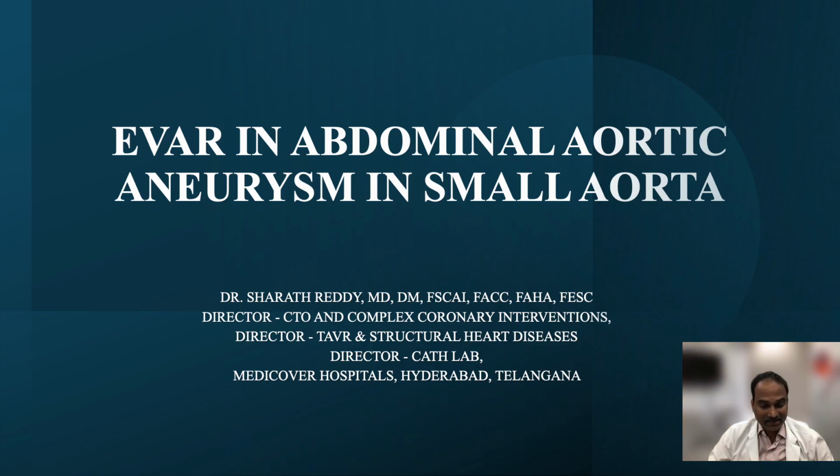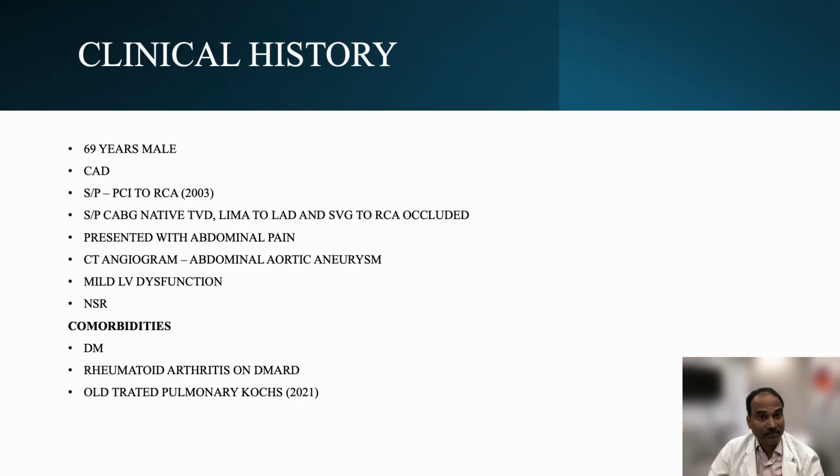Today's case is an interesting case, away from our routine cases of coronary CTOs and complex PCI or CHIP PCI. This is a case of abdominal aortic aneurysm in a small aorta.